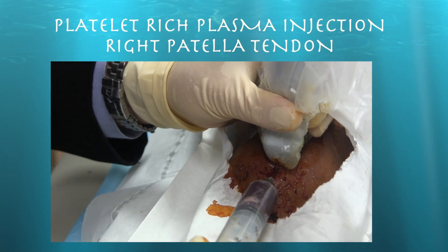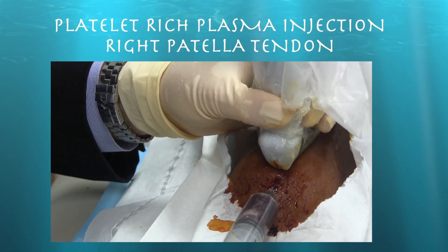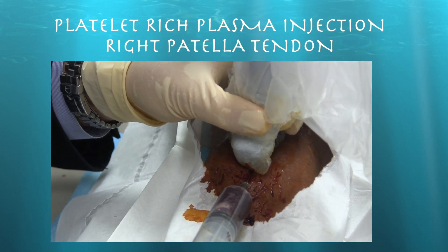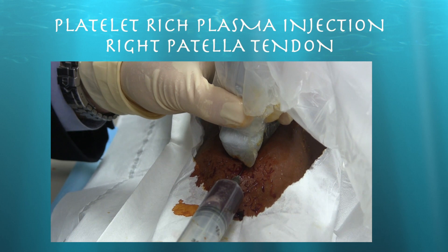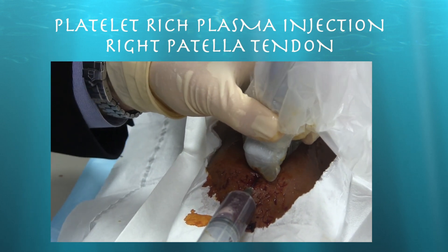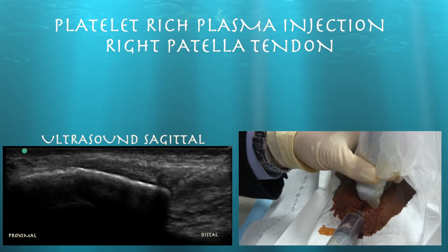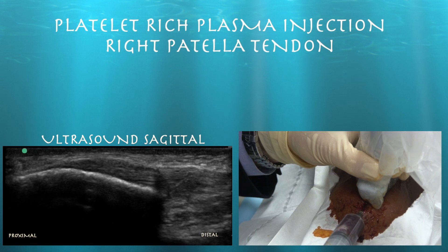Now we're going to start injecting. Is the injection going to hurt? Yeah, it probably will. Just try to stay still — you're going to feel some pressure. Here's the needle: it goes right to the bone and we're injecting it basically within the tendon itself. That's the bright line that you see on ultrasound.